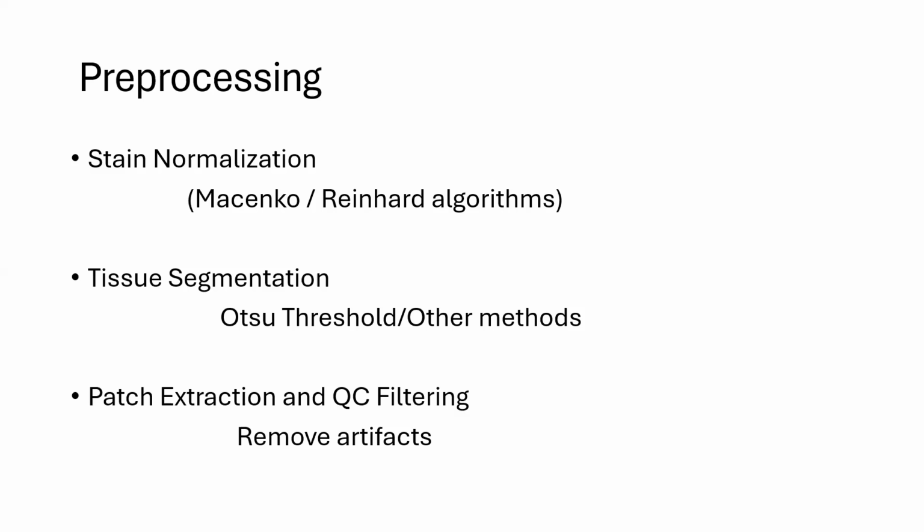So for our pipeline, what do we have to understand as the need? We have to apply the segmentation accordingly. In the case of people who are working in biomedical, they can go for an ablation with different types of segmentation and different types of normalization. They can apply them and find that the results are different.